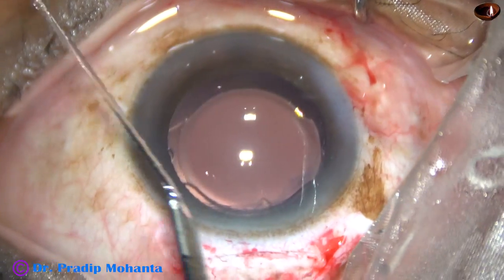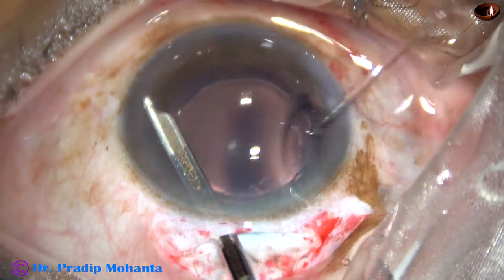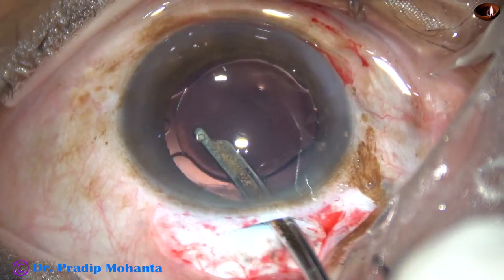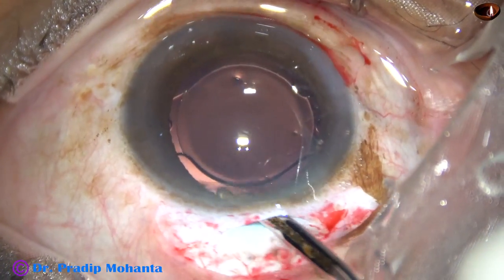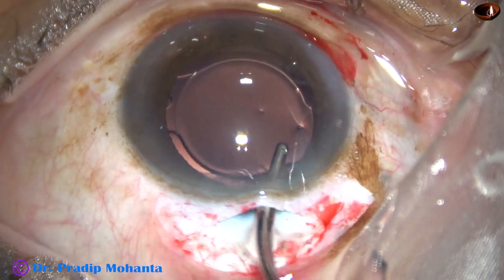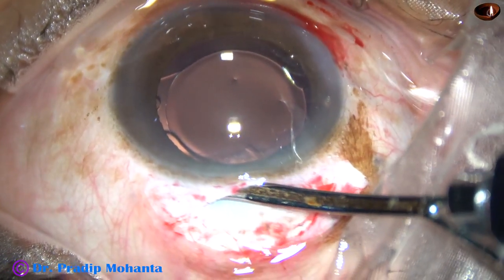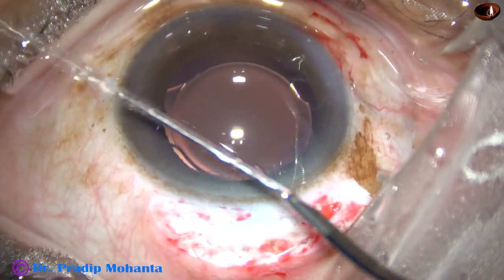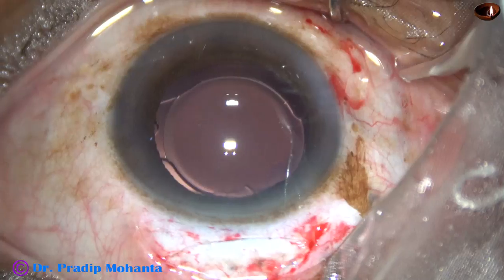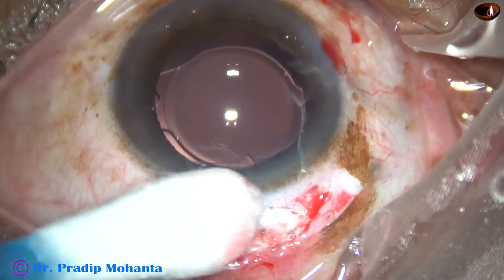The side port is closed by corneal stromal hydration, and then this is the final lavage of the anterior chamber. The anterior chamber is nicely irrigated. Center the IOL well, go behind the IOL and irrigate some more fluid. Place the IOL nicely, and now the anterior chamber has to be formed very nicely. Put the Simcoe in — all the BSS goes into the anterior chamber, BSS is ejected — and suddenly come backward and upward and the anterior chamber will be nicely formed.